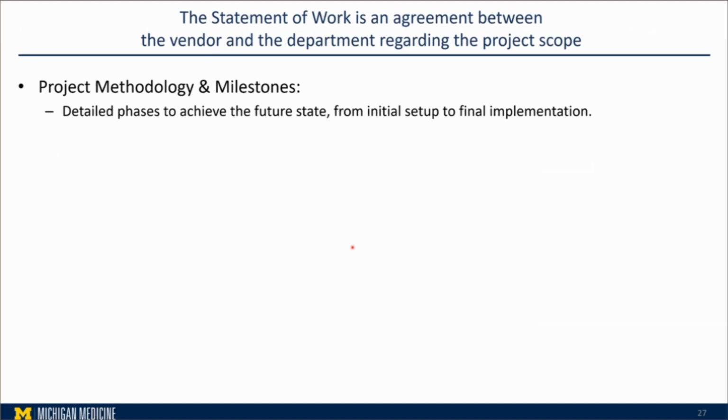Just make sure that you have the vision to put it into account, and it helped us a lot, because, for example, in phase 1 and phase 2, we were focusing on going digital, while in phase 3, we were focusing on maybe implementing third-party AI solutions or quantitative image analysis, and we just put it into account. Even if right now you don't have the exact vendor, for that image analysis or AI, maybe you give a selection of 3 vendors that we're going to work with in the future, and that helps a lot.